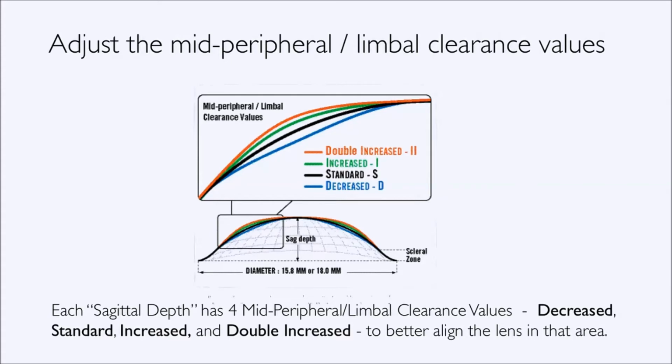We don't call it the base curve because we don't want you to think that if you want to increase the sagittal height, you're just going to change the base curve. That's all done by the manufacturer, by Blanchard Contact Lens, as they control the reverse geometry curves in the mid-peripheral zones of the lens.